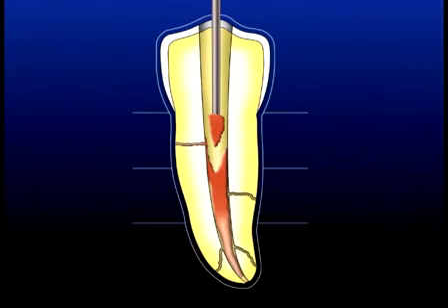The first result of this action is the progressive apical transfer of heat along the master cone another 4 to 5 millimeters. The second result of removing a bite of gutta percha is that a smaller pre-fit plugger can be placed progressively deeper into the root canal preparation where it can vertically pack warm gutta percha. Again, gutta percha will 3-dimensionally fill the preparation laterally and in a depth over a range of 4 to 5 millimeters, producing a second wave of condensation, the piston effect, and resultant sealer hydraulics.